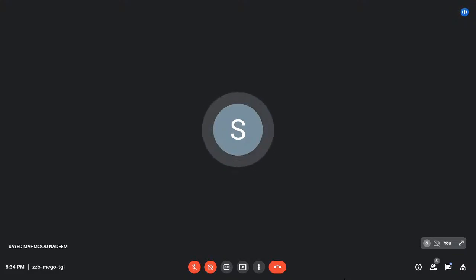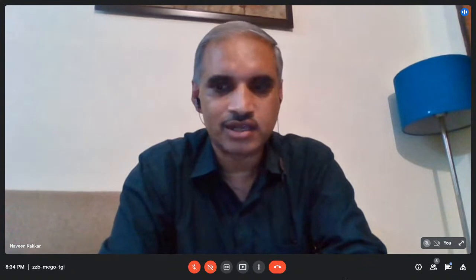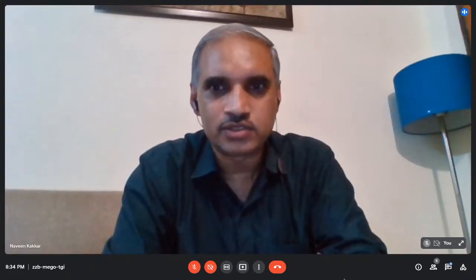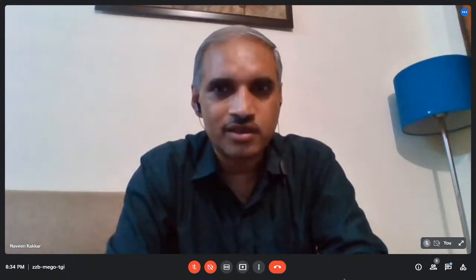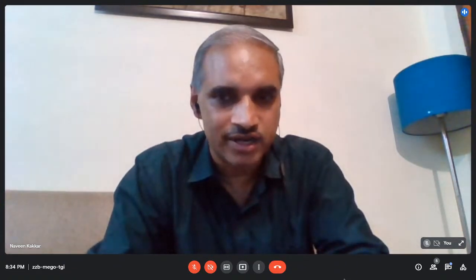It starts with Dr. Sudipta Naskar from YouTube. He says, in case number 2, which you presented, what does the peak just before HbF indicate? I probably need to go to my slides, one second. You can share also if you feel like, no problem. I'll just speak it out. Those are just minor initial peaks, degradation peaks only. Before F, it is only very minor peaks which will contribute maybe 0.2 or 0.3%. They are minor starting degradation peaks, nothing to be worried about.